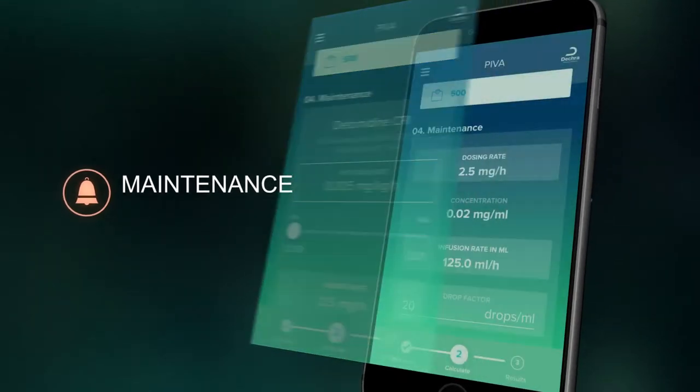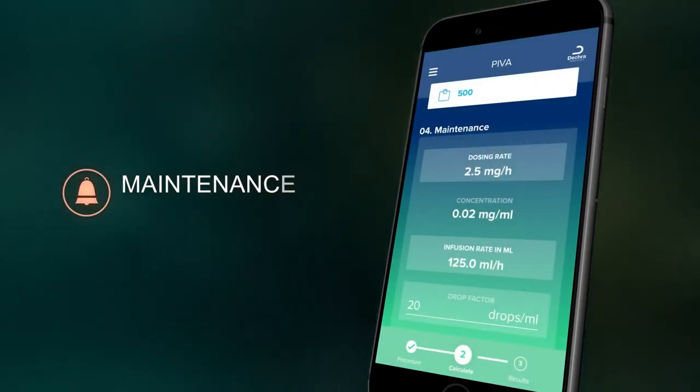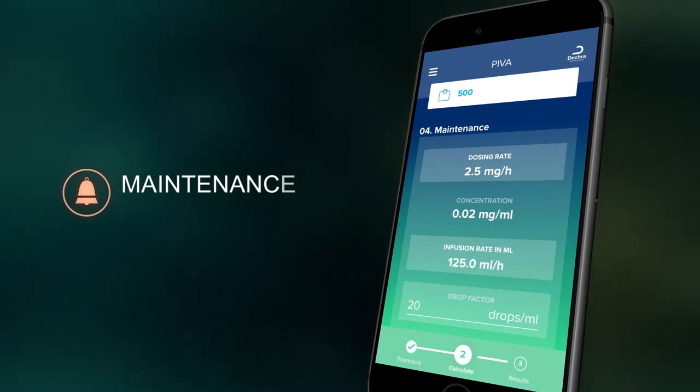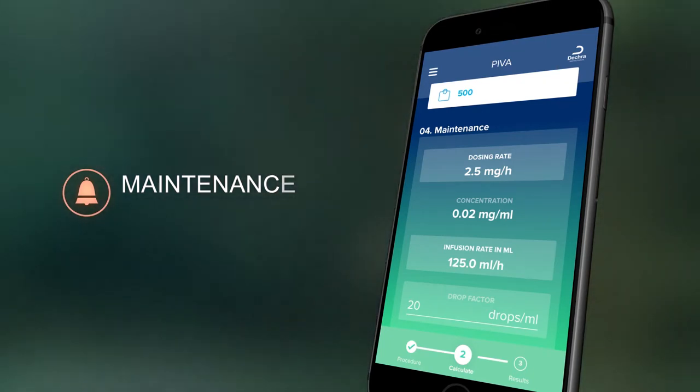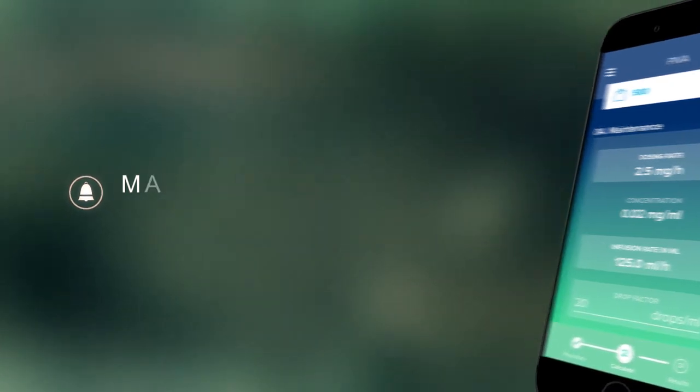The dose calculator will calculate the administration rate of any drugs to be infused, cutting through the complexity of equine anesthesia and making it straightforward to use a partial intravenous protocol.